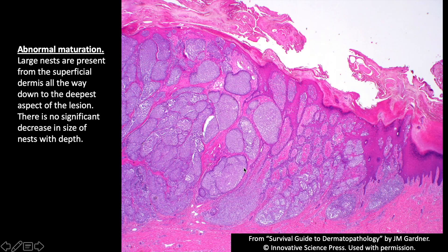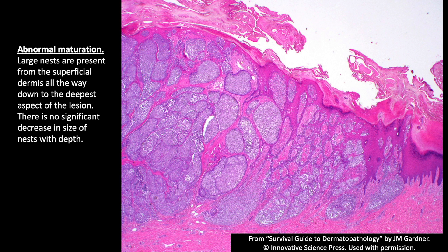Maturation is another feature we talk about a lot, but in real life it can be tricky to evaluate — it's usually only very helpful in really big, thick lesions where you have many melanocytes going deep into the dermis. Here you can see huge nests and large melanocytes all the way down to the deep aspect of the lesion. Normally, nevi start with larger melanocytes and larger nests up top, and as you go deeper they trickle down into little single cells in the dermal collagen.